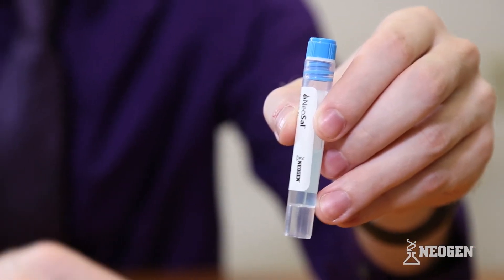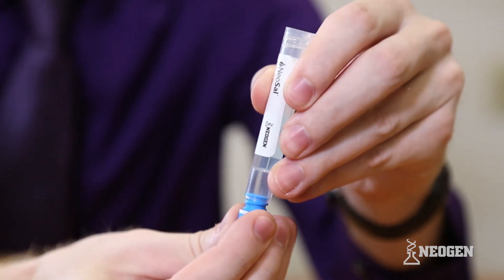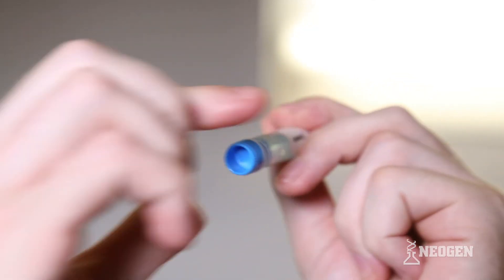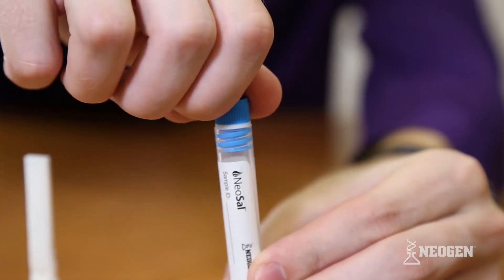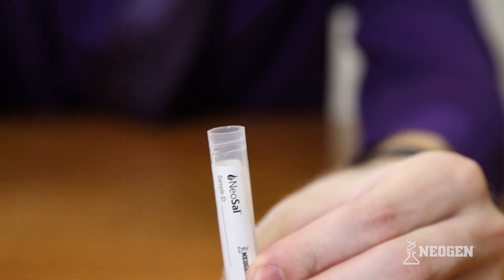The unique design of the buffer tube allows for easy removal of the cap and convenient storage of the cap in the bottom of the tube. This enables the laboratory to easily access the additional buffer tube cap when the sample arrives at the laboratory for processing. The buffer tube design also allows for tamper-proof tape to be used if required by your laboratory.